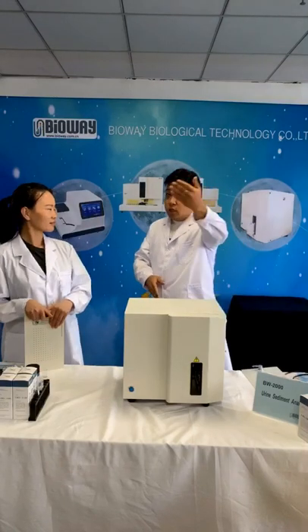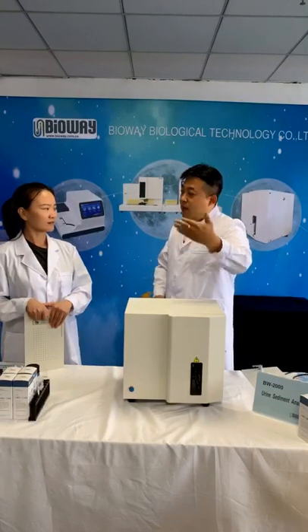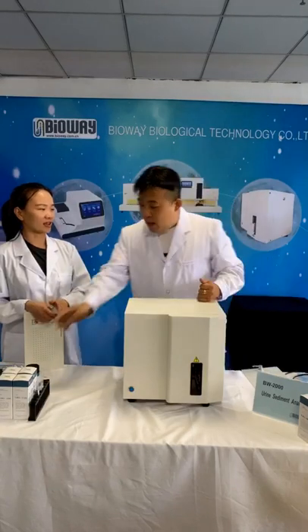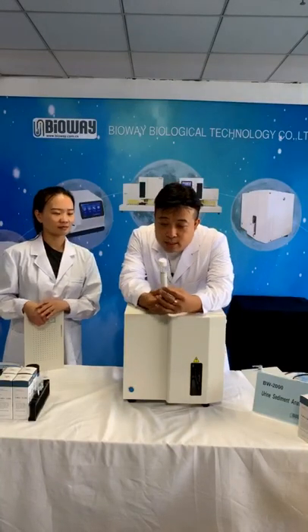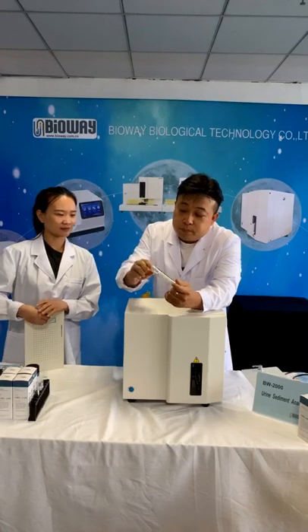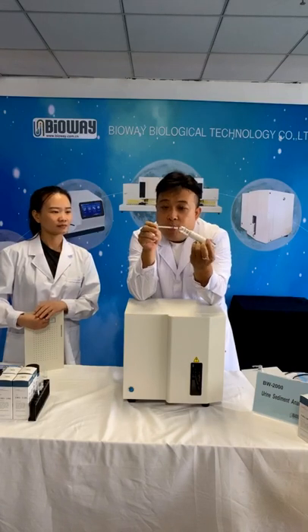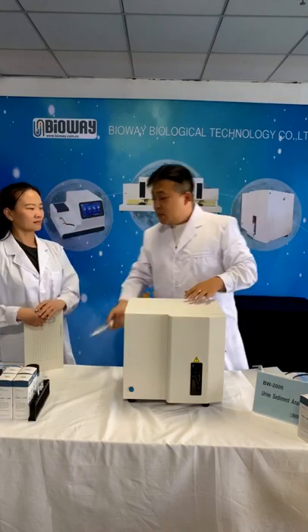And also quality control must have the target result. Comparing with the target result, you check whether the machine's result is good or not. So we can provide our clients quality control. As with the urine chemistry analyzer, we have the quality control strips like this. And we have the barcode here and get the final result comparing with it, that is done. And it is the same with the urine sediment analyzer.